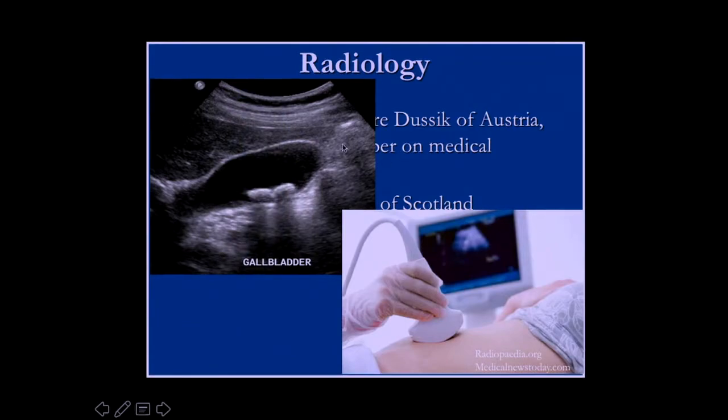Or here's somebody with a gallbladder. The fluid is dark. Sound goes right through it. It's bouncing back from gallstones. So very portable, very quick. As many of you may have had an ultrasound, it's a pretty cool technique as well.